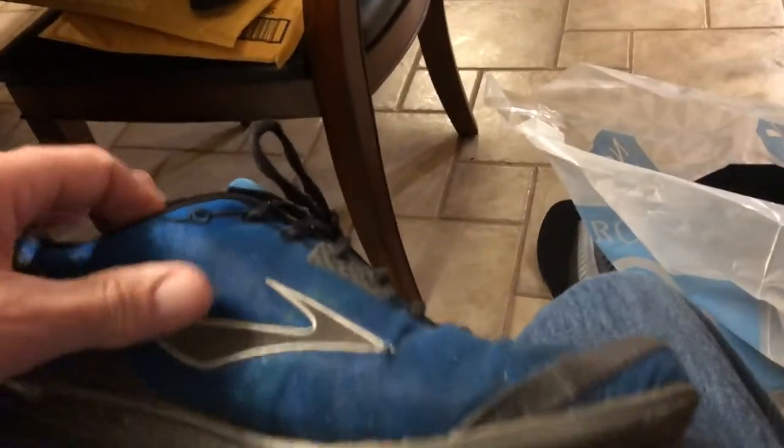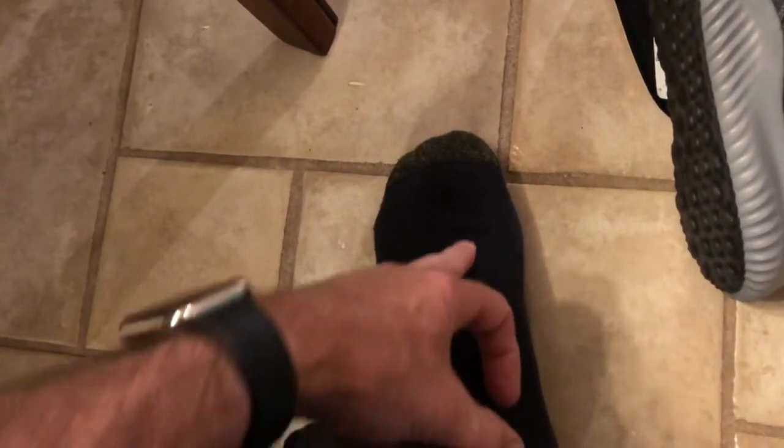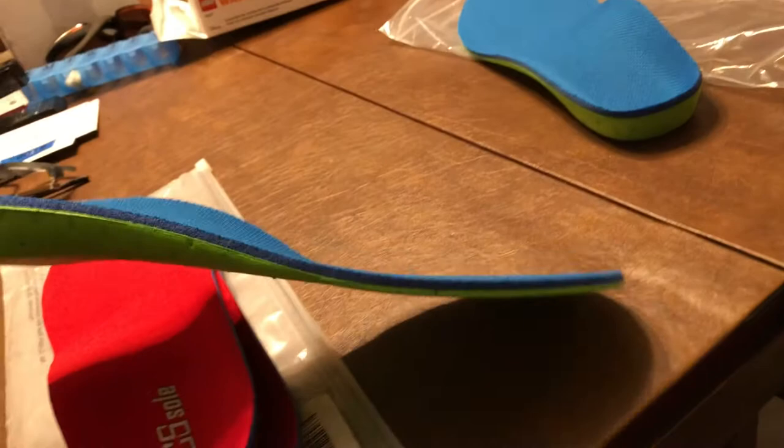My biggest issue with that insert is that it's too padded in the front. I'm already running into a problem where wearing a shoe bites into my left foot and puts the front half of my foot to sleep mid-day. My podiatrist said there's a nerve running across the top of the foot that could be getting pinched. The last thing I want is an insert that raises my foot even higher.